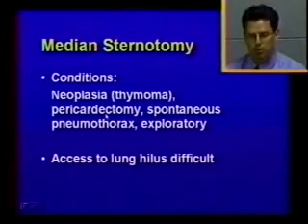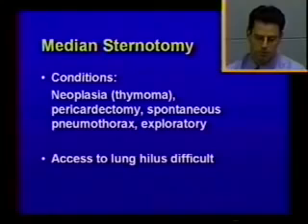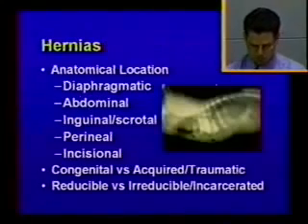Pericardectomy can also be performed through median sternotomy, and it is the preferred technique if we need to perform an exploratory thoracotomy to visualize all the different lung lobes, such as with spontaneous pneumothorax, where we're not sure in some cases where the lesion is. Access, though, to the lung hilus is difficult, so it is difficult to remove lung lobes from this approach.